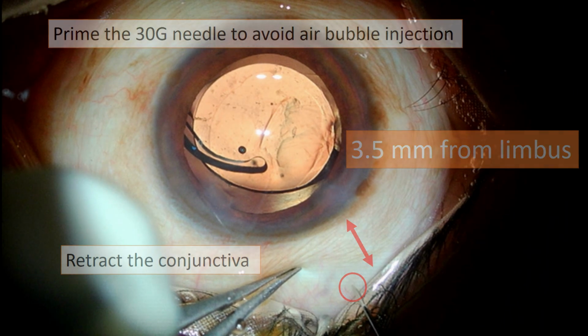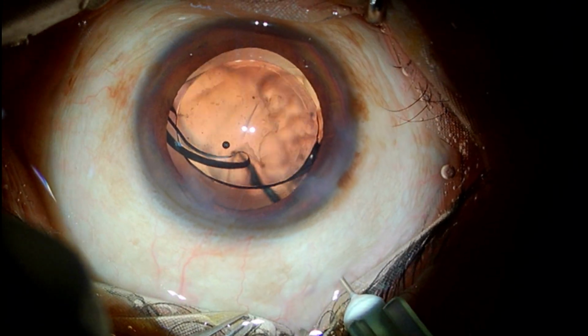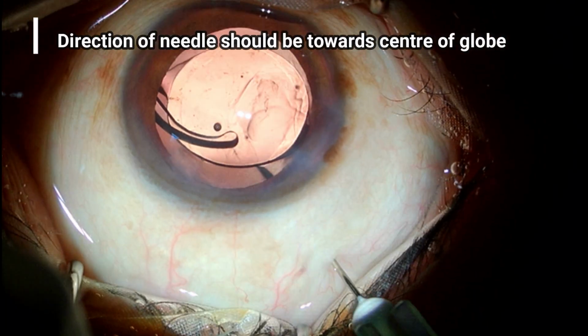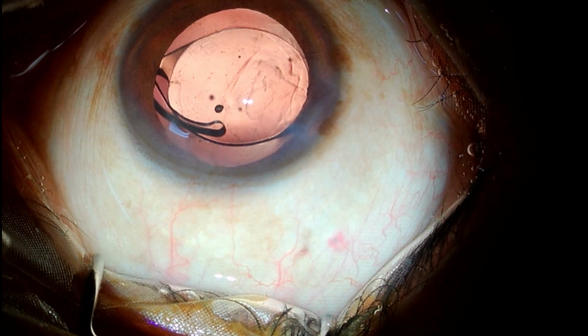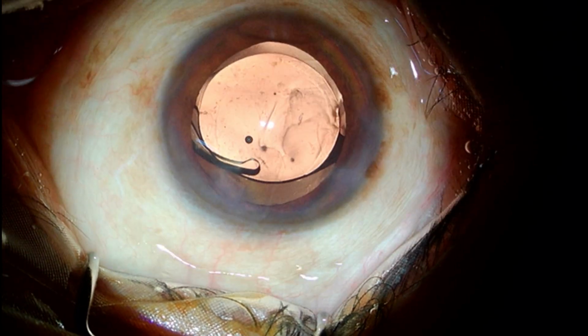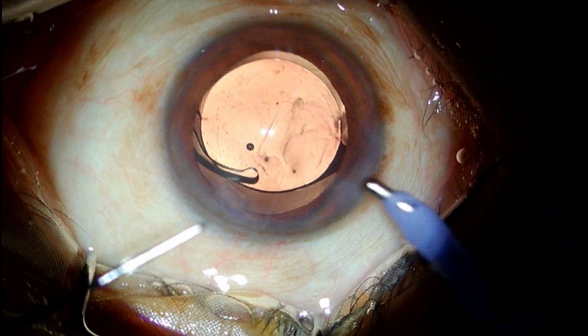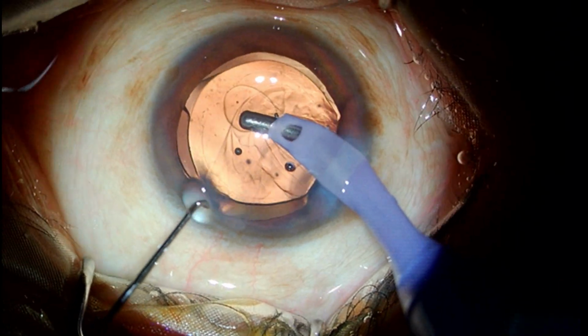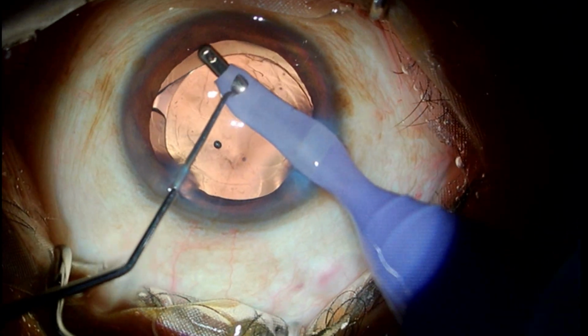Once you are ready, then you can direct the needle towards the center of the globe, visualize the tip and then inject. Once this is done, you can do the visco removal by using I/A probe, and that's the end of the procedure. It's a very simple technique to perform and patients are quite comfortable during this.